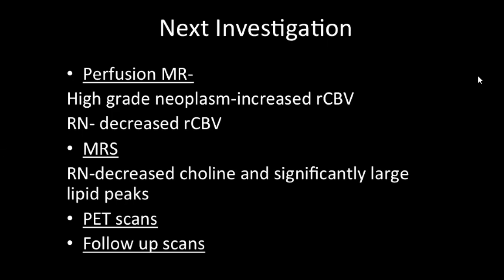On perfusion MR, keep in mind that the regional cerebral blood volume is decreased in cases of radionecrosis, however it would be increased in cases of tumor recurrence. Similarly, on MR spectroscopy, there is a decreased choline peak and a significantly large lipid peak, which represents necrosis. But still, you are not very sure.